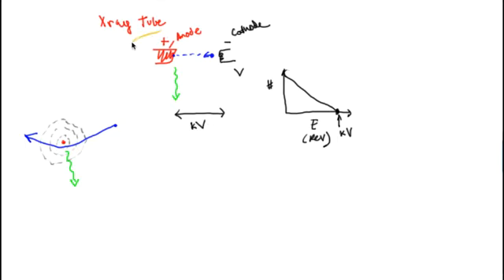Okay, now there's other effects, though. In particular, this tube is encased in a glass casing that's then evacuated to a high vacuum. Why is it in a vacuum tube? Well, because these electrons flowing through the tube need to go through a vacuum and not collide with air molecules. Also, there'd be an arc between the electrodes because they're at high voltage if it had air in there. So it's a high vacuum. And then there's a window here which allows the X-rays to come out. That's typically made out of beryllium.